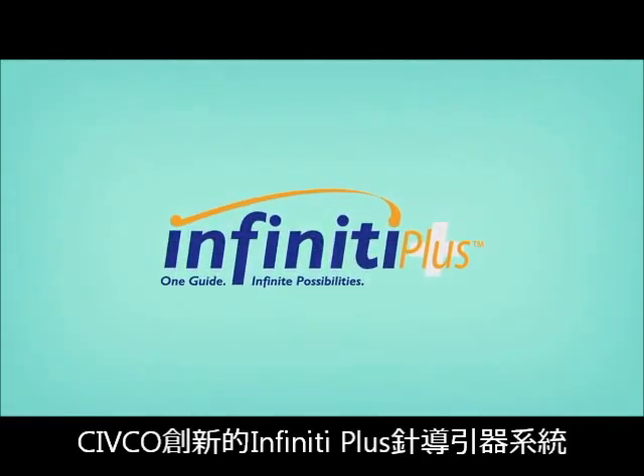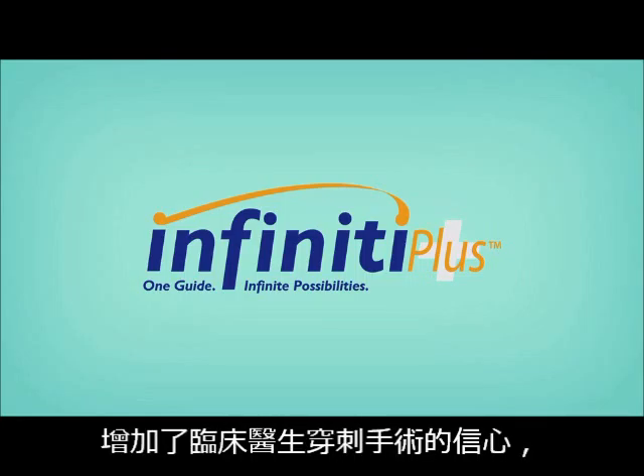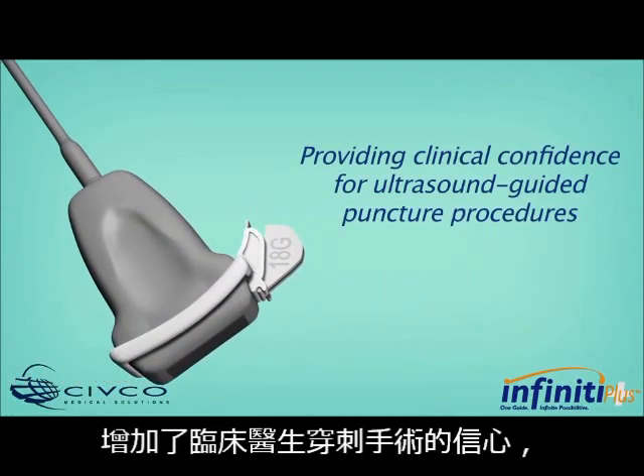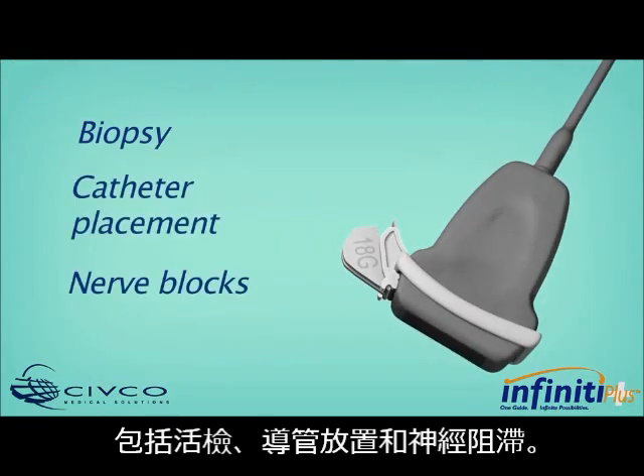Reliable in-plane positioning is made possible through CIVCO's innovative Infiniti Plus Needle Guidance System, offering infinite angle capabilities and providing clinical confidence for ultrasound-guided puncture procedures, including biopsy, catheter placement, and nerve blocks.